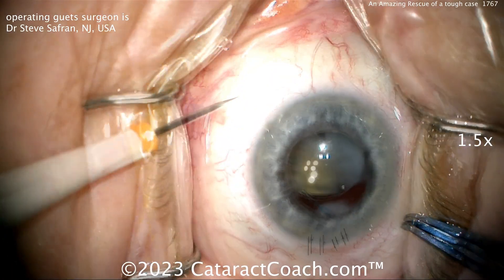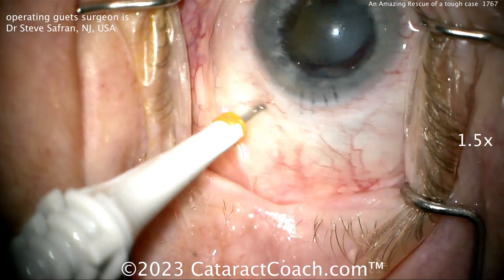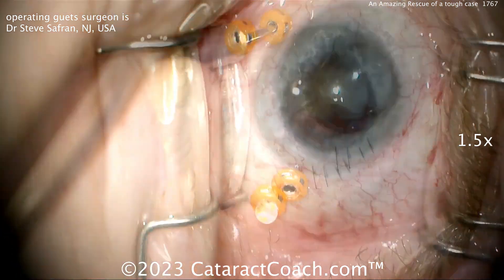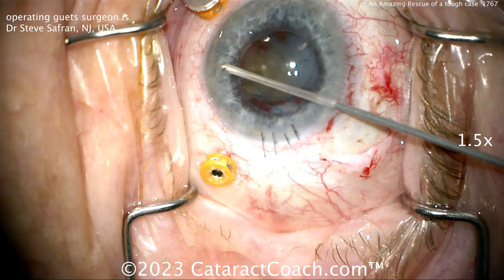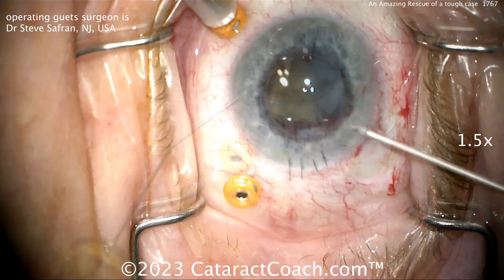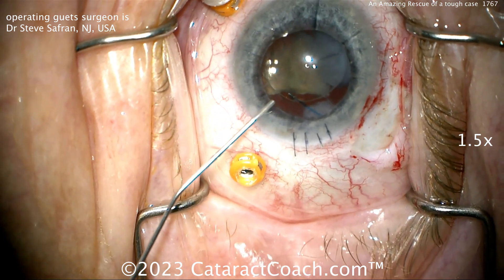This is a very tough situation. Our guest, Dr. Steve Safran from New Jersey, does these cases all the time. He's putting in a couple of trocars to do a pars plana vitrectomy, going in with a retractor, taking out small pieces from the AC, viscoelastic going in, and now going to get that lens up.